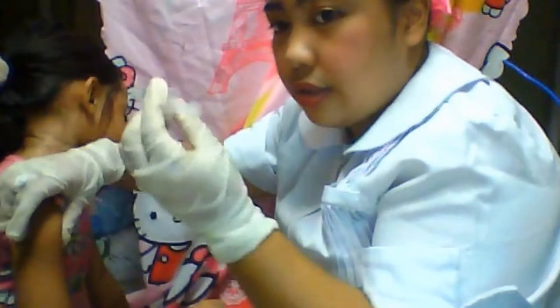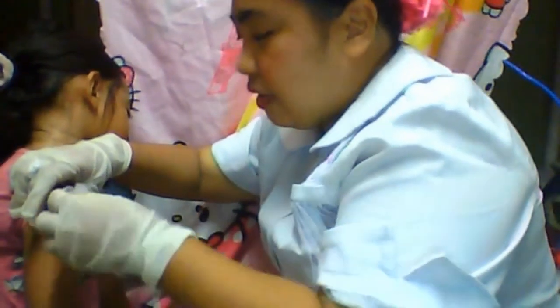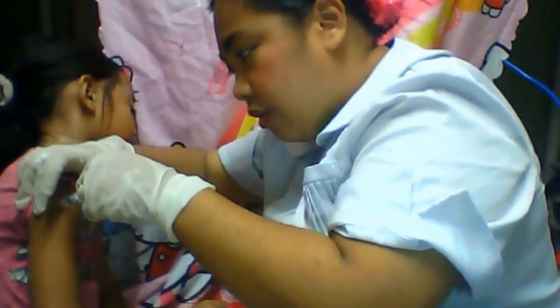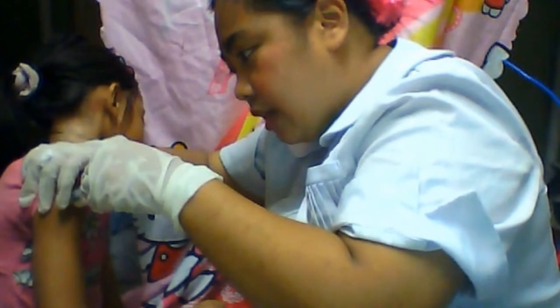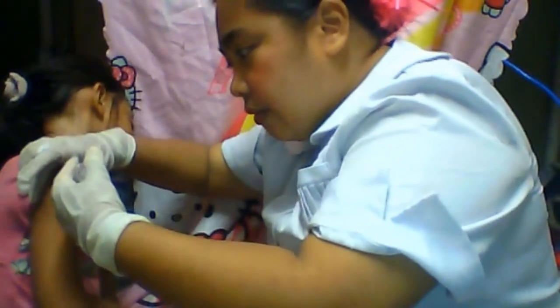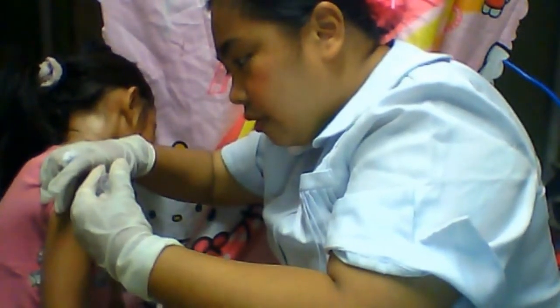So you do the dart technique, you do it like that, aspirate. Okay, you can also hold this one, thumb and index, aspirate, no blood, and then pinch again a little bit, and then introduce the medication.